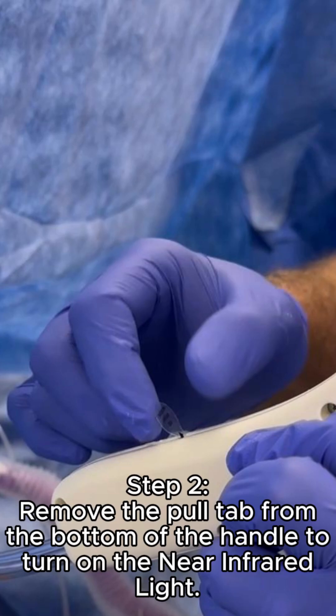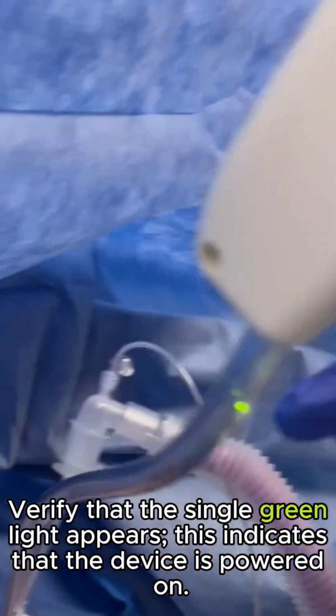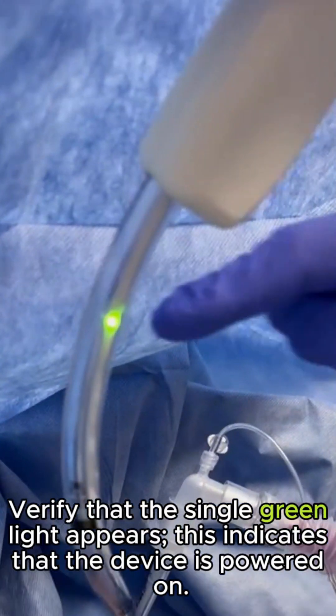Remove the pull tab from the bottom of the handle to turn on the near-infrared light. Verify that the single green light appears — this indicates that the device is powered on.